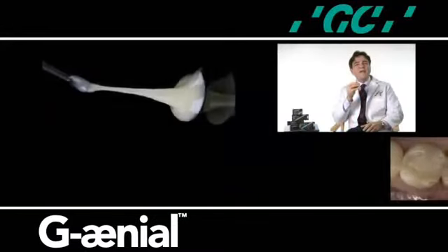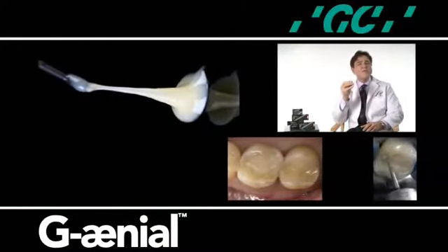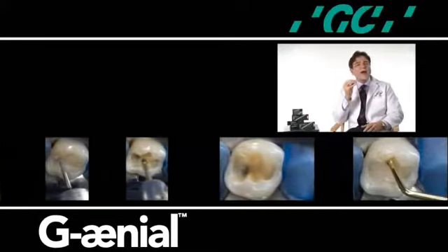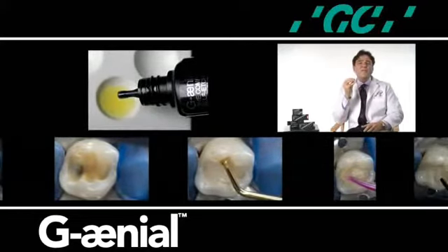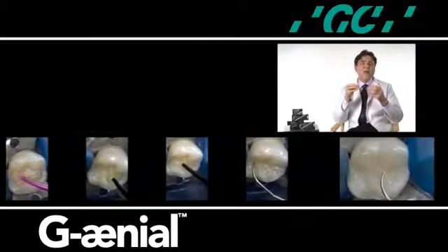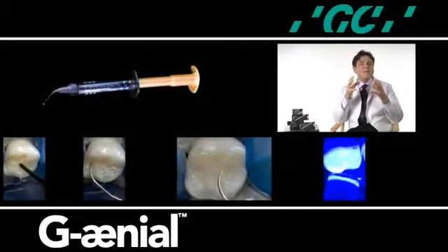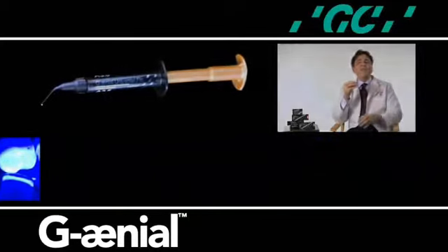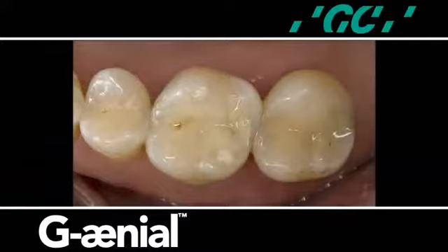G-aenial resin nanotechnology provides composite resin with filler particle size that is dramatically smaller in size and can be dissolved in higher concentrations and polymerized into the resin system with molecules that can be designed to be compatible when coupled with a polymer and provide unique physical, mechanical, and optical characteristics.